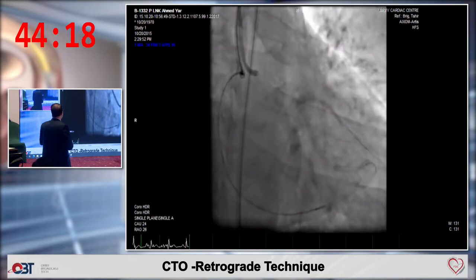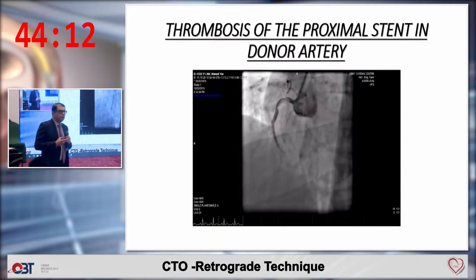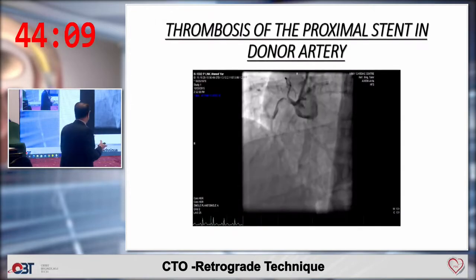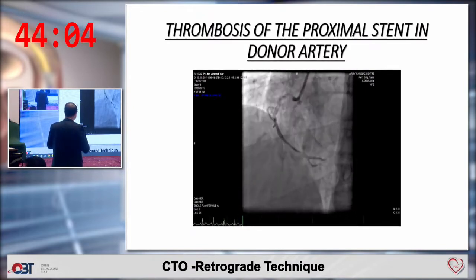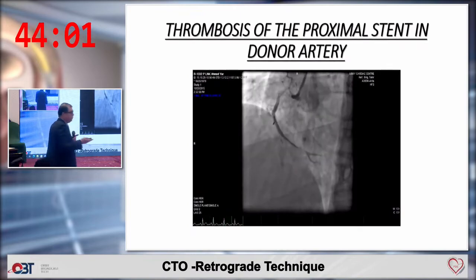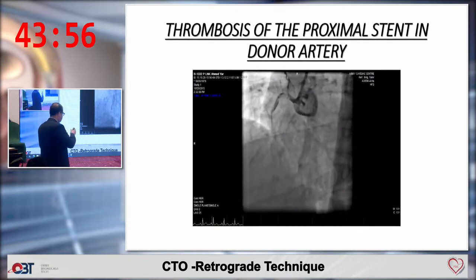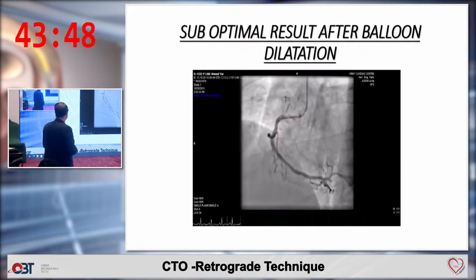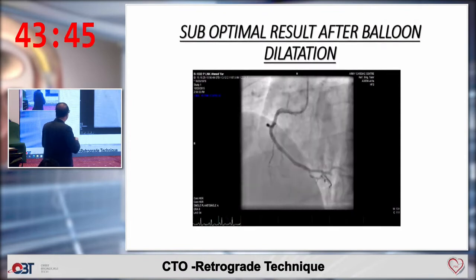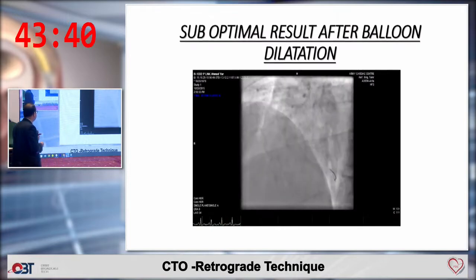And this is after, but the case is not over. So you have to take a picture of the donor vessel because although we were monitoring the ACT, somehow there was thrombus formation in the donor vessel. It is possible because we had a wire in the conus branch as well. This is how it looked. Although the patient was quite stable, we first ballooned it with some suboptimal results, so we had to stent this portion. Maybe it was a dissection or a thrombus because our ACT was always optimal.